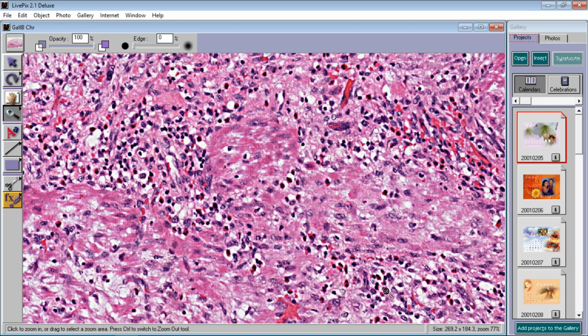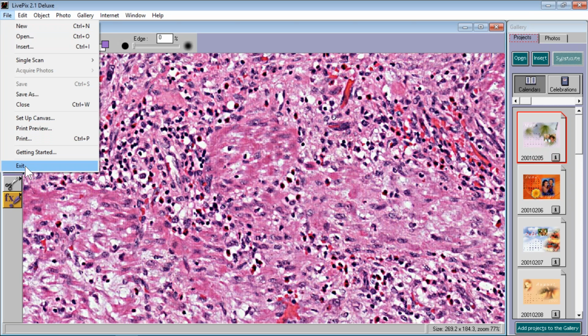So that's why some pathologists, if they looked at this gallbladder, they might call it acute and chronic cholecystitis. Okay? Now, what do you think would be more dangerous to the patient? An acute cholecystitis or a chronic cholecystitis? It's an acute because now there's more extensive damage and weakening of the wall. Chronic cholecystitis is very, very, very common and usually not even clinically apparent. Okay, so good. We did gallbladder.